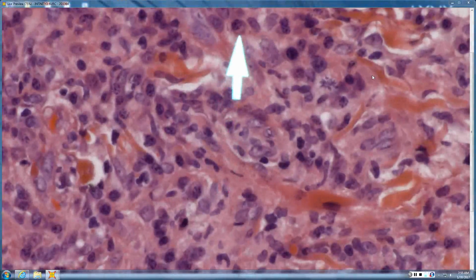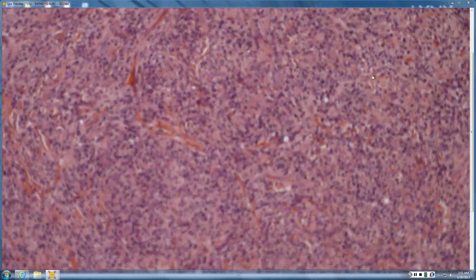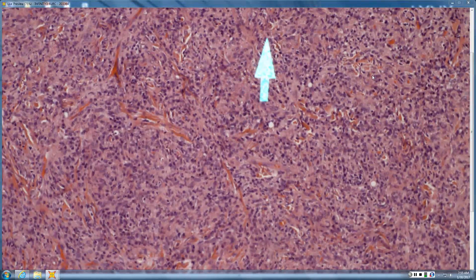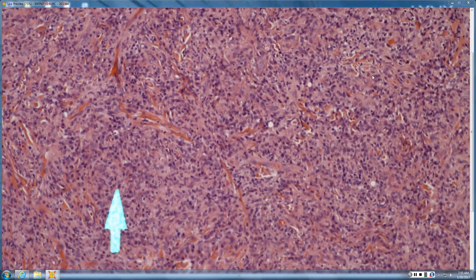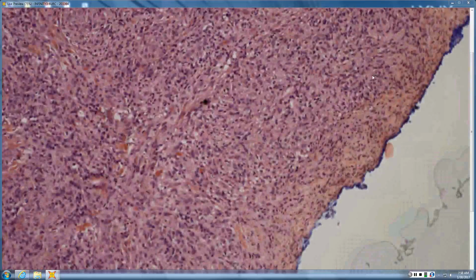Any cell types here? A lot of plasma cells. I want to know site. So plasma cells, and you'd want to know site to see if it's a site where the plasma cells are just being recruited or not. And unfortunately, we don't know site on this slide. Here you have a cluster of nuclei on a background of pink cytoplasm. It's probably a giant cell. Yeah, and in fact, there are a lot of those. So it's a diffuse interstitial and granulomatous infiltrate with plasma cells in an HIV patient.